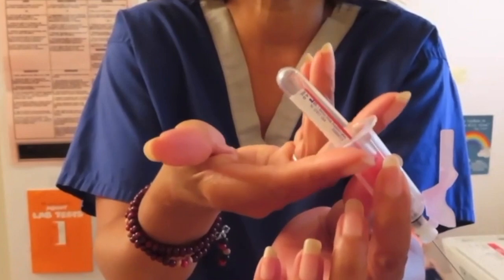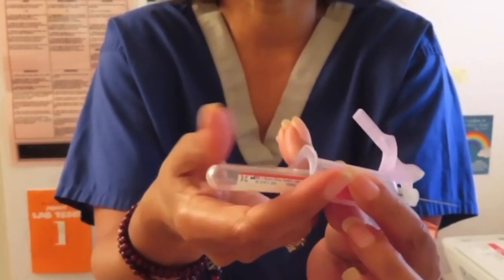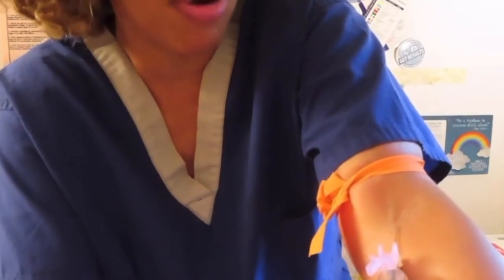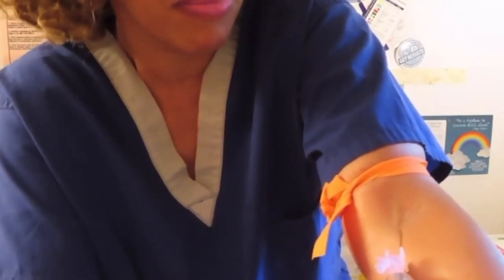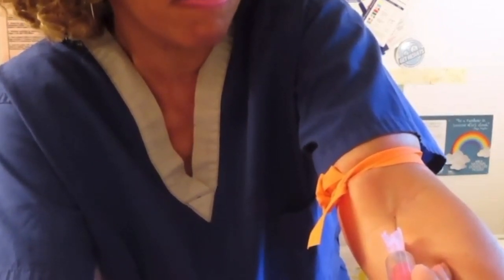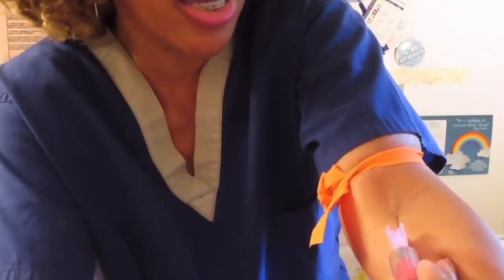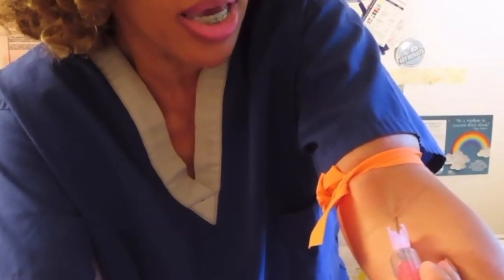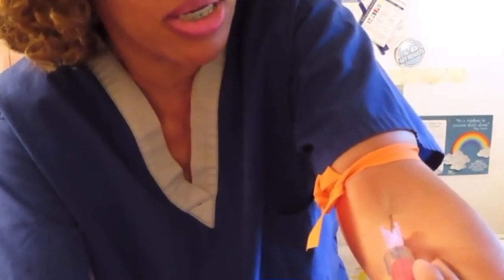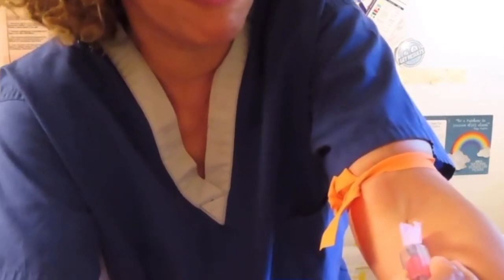I use the feet. I hold. I go ahead and look for my site. We're going to stick right about here. And it's just a nice, gentle glide into the vein. And you'll know when you're in there. And we've talked about this several times. It's just a nice little puncture that you'll feel.